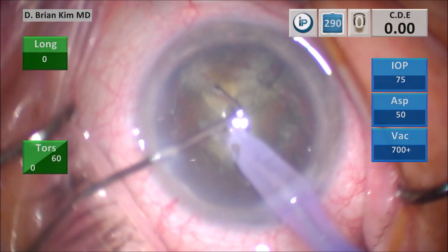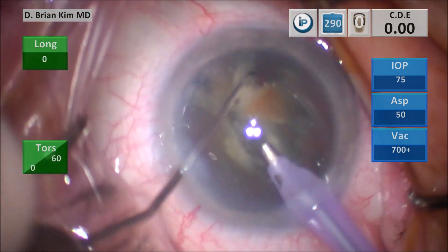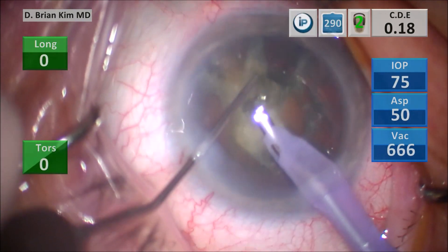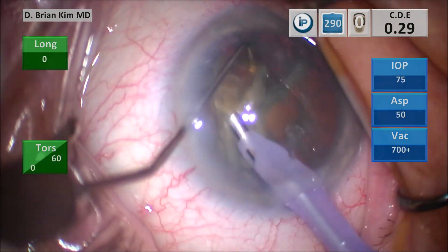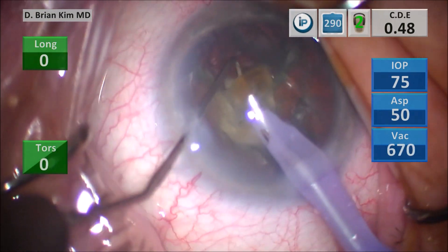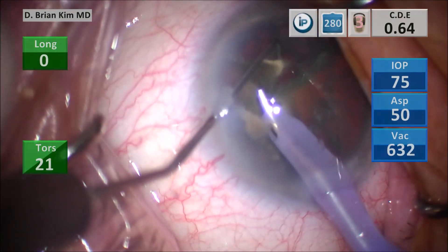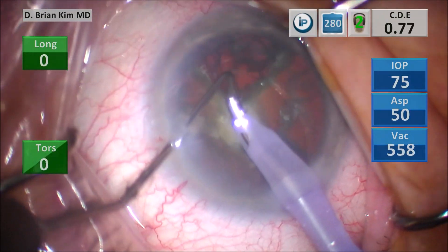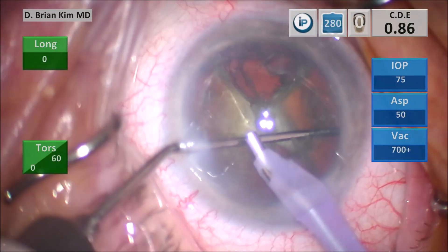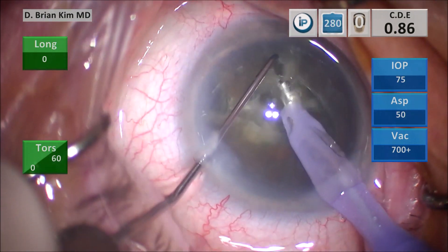I place the chopper out again underneath that first quadrant, crushing that lens between the chop and the phacotip. I start to crush that lens piece into smaller pieces and then begin to emulsify it, grasping that second fragment and crushing the lens piece between the chopper and the phacotip, then using high vacuum and a little bit of ultrasonic energy to remove the lens piece. I place the chopper out to the equator again for another cross chop maneuver, pulling the chopper towards the phacotip and crushing the lens material between them.